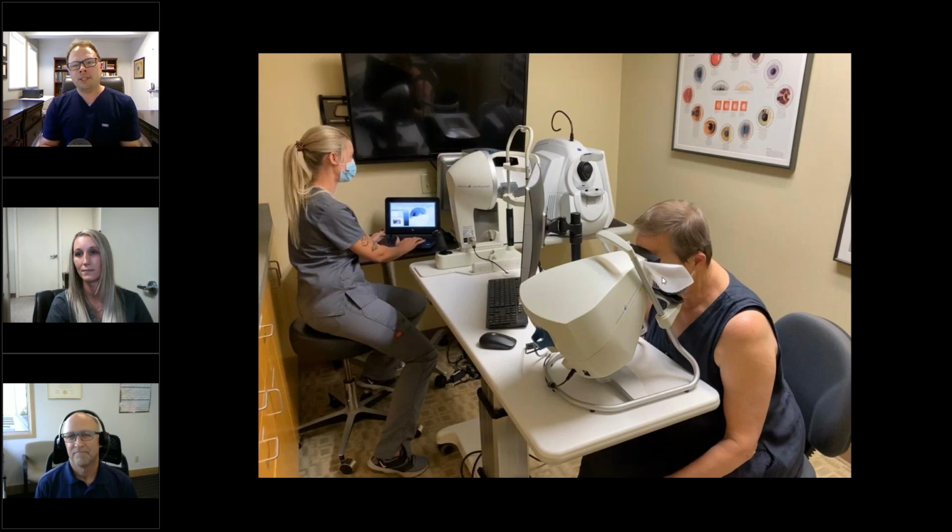It's a pretty decent screening tool. Like so many perimeters, there are some false positives, probably a little higher maybe on the FDT. And those are the ones where on-demand perimetry is particularly valuable. You get a false positive that looks like a nasal step. You tell the patient, oh, you might have glaucoma. They go home, they wait a month, and they Google it every single day, and blood pressure goes up. And if you can do an on-demand perimetry right then and there and say, oh, you know what? The machine was wrong. Look, you're crystal clear, nothing to worry about, see you in a year. That's a pretty huge victory.